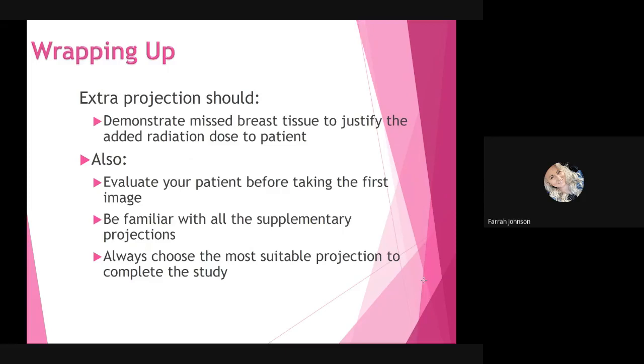Now, note that it doesn't hurt to consult your lead mammographer or your radiologist to ensure that taking this extra image is actually going to help the study, or if it's not needed. If it's not needed, then there's no reason to expose the patient to another mammographic image.